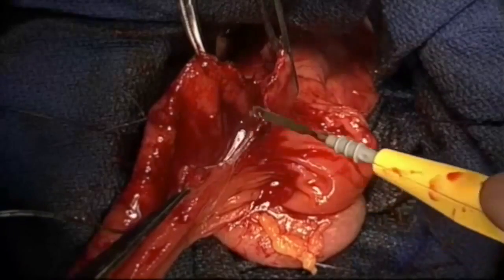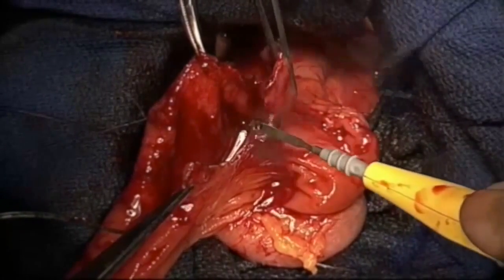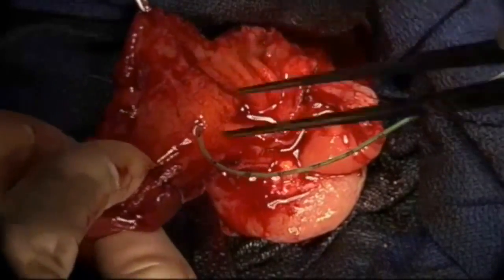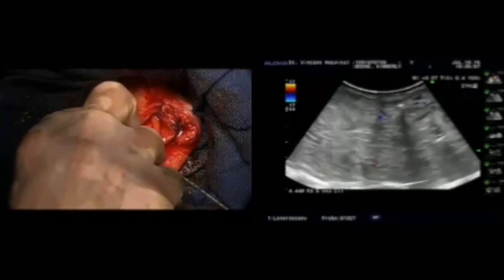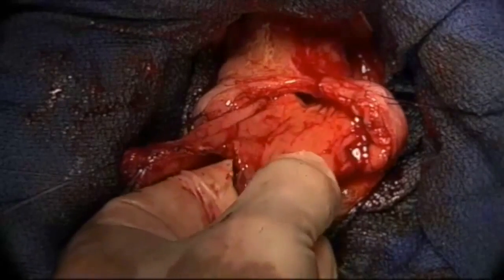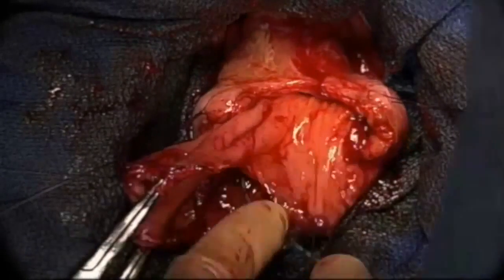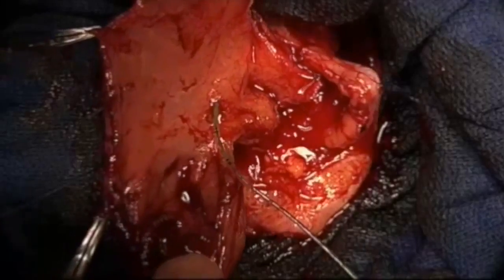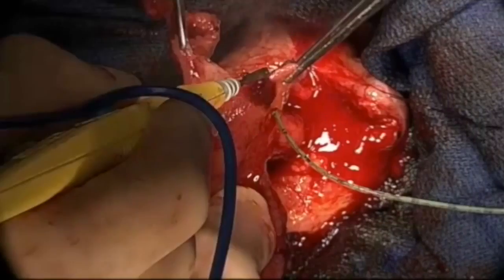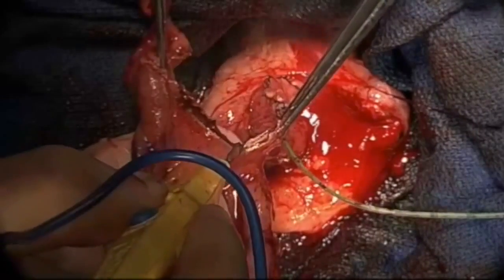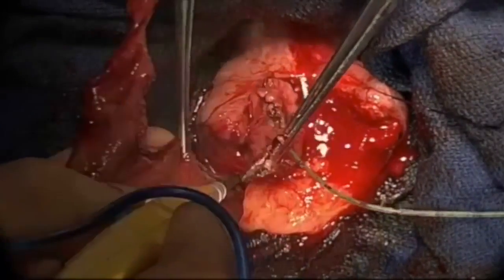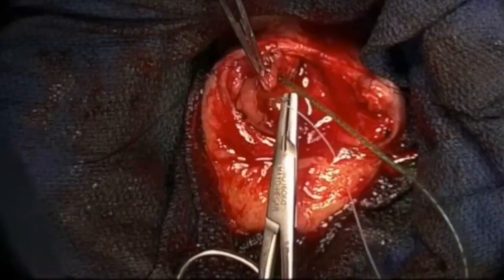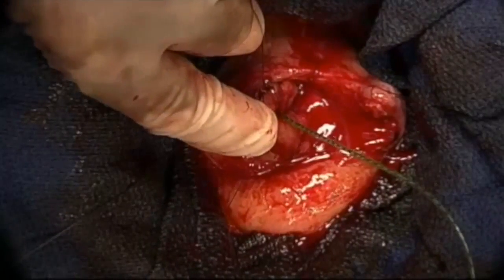We then proceeded to excise the cyst with electrocautery, taking care to avoid injury to the major papilla. The cyst was resected at its base, which had a 2 cm diameter containing the major papilla inside. We oversewed the edges of the cut cyst with running 3-0 Vicryl to achieve hemostasis. We felt the orifice was open enough that we did not need to perform a sphincteroplasty. The duodenotomy was then closed with running 3-0 Vicryl.